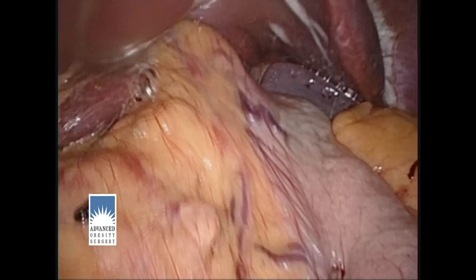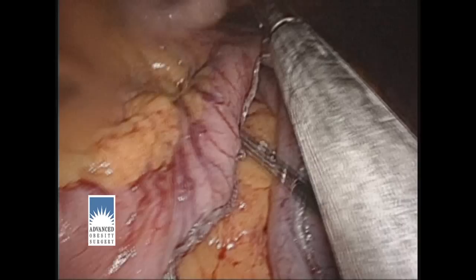Here we're repositioning the liver retractor so that we can get it out of the way and get up to the top of the stomach. If someone has a very large fatty liver, this can be a very difficult place to reach in a morbidly obese person. We now continue with the gastric resection, moving up toward the very top of the stomach.